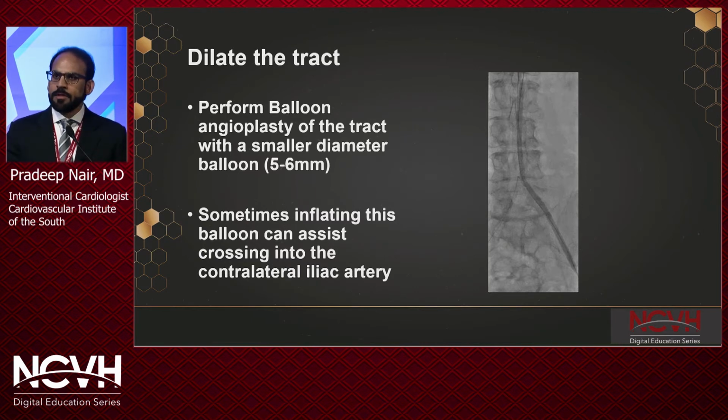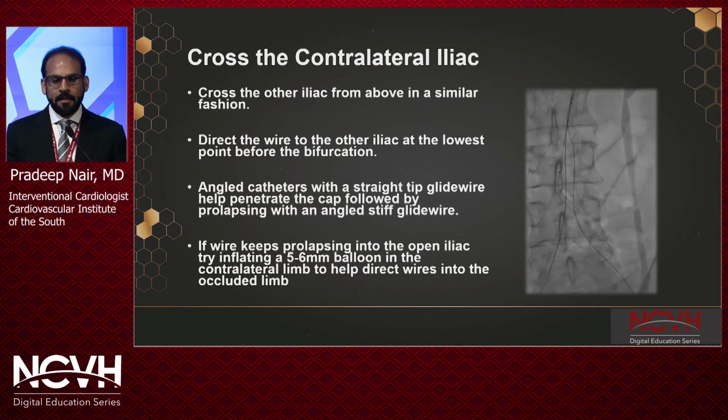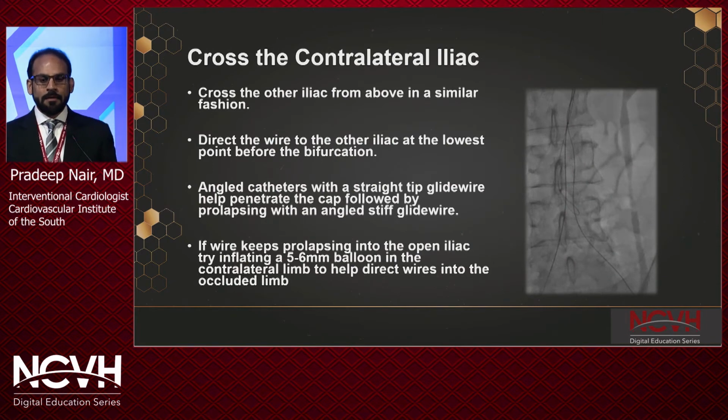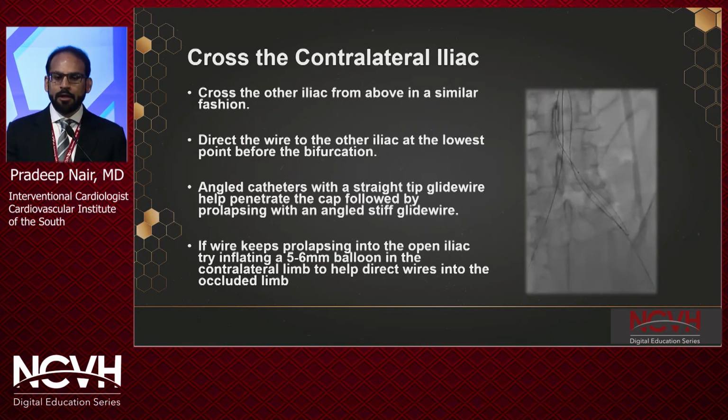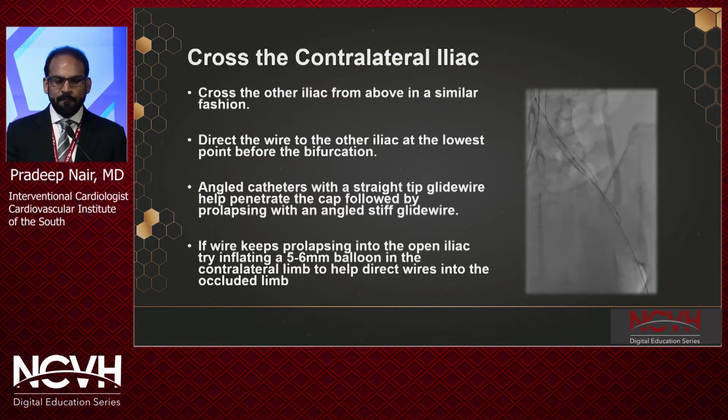And I sometimes use this balloon as an assistance to cross the contralateral iliac, as it keeps me in the same plane of the occluded iliac. So crossing this contralateral iliac is done in a similar fashion. You direct the wire to the other iliac, the lowest point before the bifurcation.